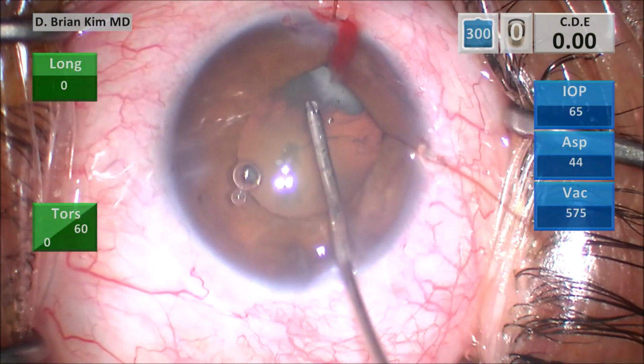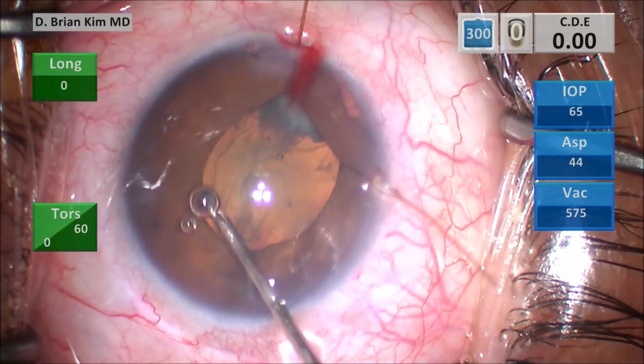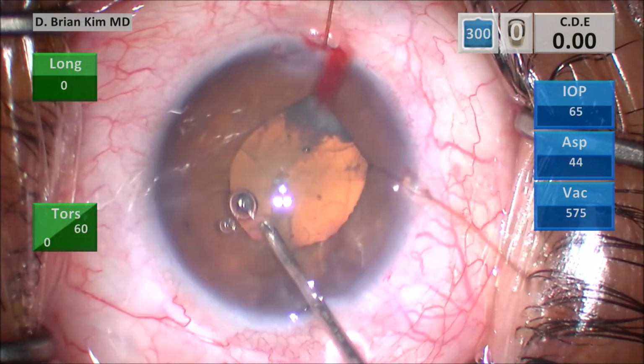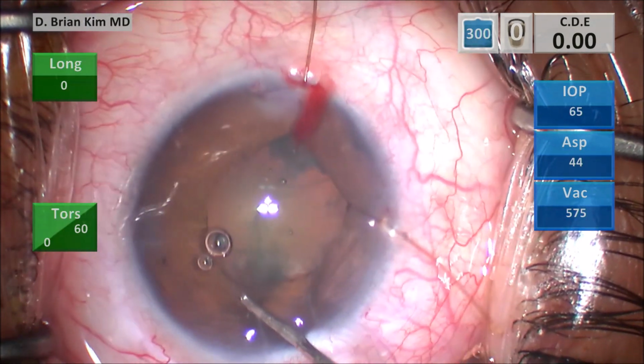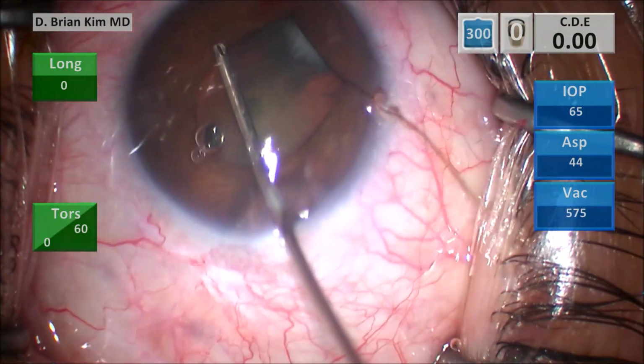You can see the whitening of the cataract in the area of the iridodialysis there. Again, I have not encountered any vitreous thus far, but of course you're concerned about the integrity of the zonules in that area. Okay, there you go, finished off the rhexis.